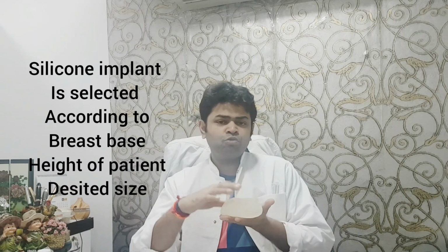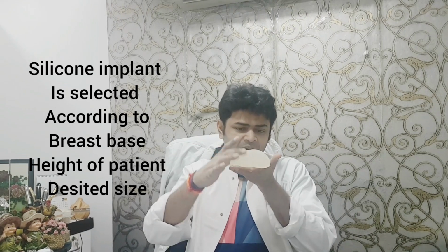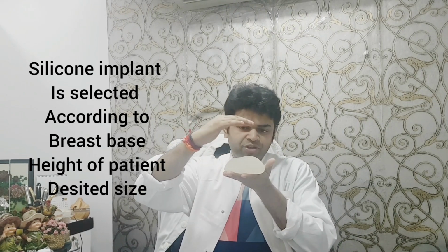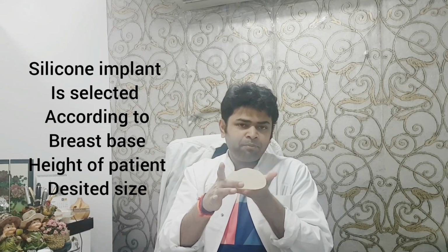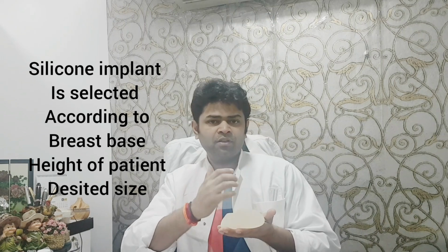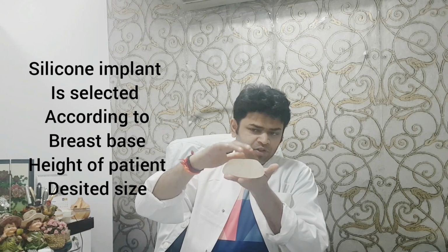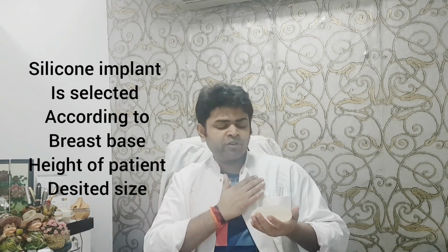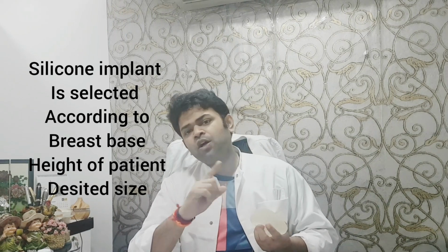Now, for the first patient who says she wants a bigger breast, I would choose an ultra high profile. An ultra high profile for the same base diameter gives a larger projection. Therefore, I would choose an ultra high profile with the same base diameter, and that will give a larger breast. The second patient, I will probably choose a moderate profile, which is not too high for the base diameter, and therefore it will not give a huge projection, but that is exactly what the patient wants. So that's how we select. Now, in terms of costings, there may be minor variations based on the profiles.